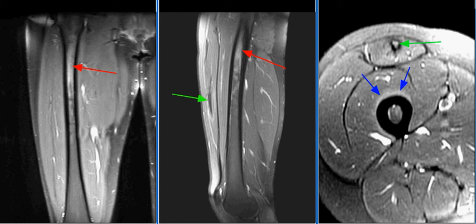There is mild edema along the indirect head of the rectus femoris muscle, suggesting a superimposed subacute component of muscle strain.